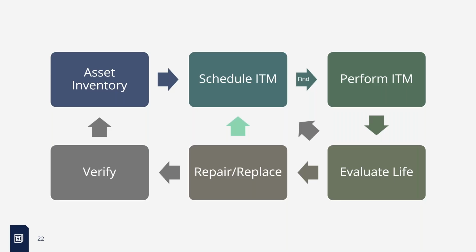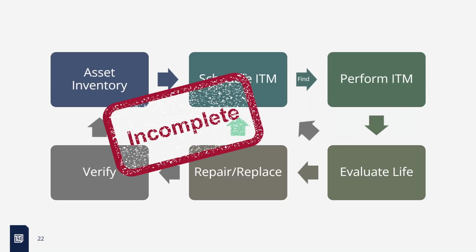You could talk to people in that area and maybe go to another area to do that as well. But this is never done. You're never done with this one. I was at a presentation earlier today. He said, verify your equipment asset inventory quarterly. But if you're doing it on an ongoing basis, every time you're doing the PMs, you're constantly keeping your inventory up to date, especially if you're not finding it.